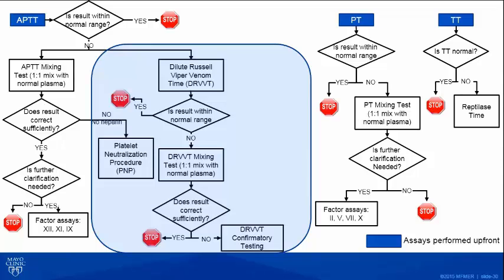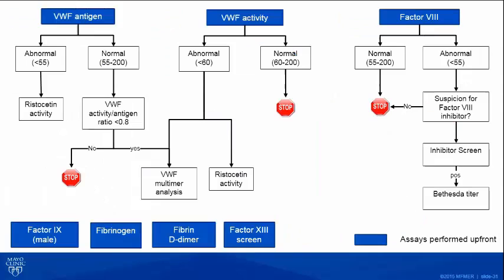Clinically, we know that lupus anticoagulant usually gives thrombosis rather than a bleeding diathesis, but it's an important differential to work up a prolonged and inhibited APTT. As a reference lab, even though we ask people to fill out the clinical information sheet, most of the time we don't get it. So to close the loop, we felt it's prudent to include it. But if you are offering the test in your own lab, it's your own clinical judgment.